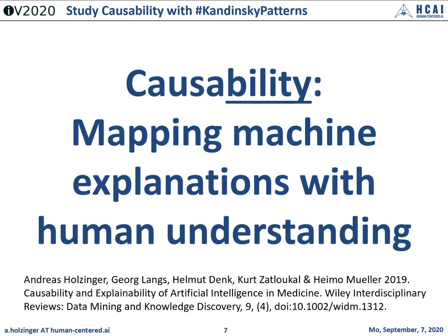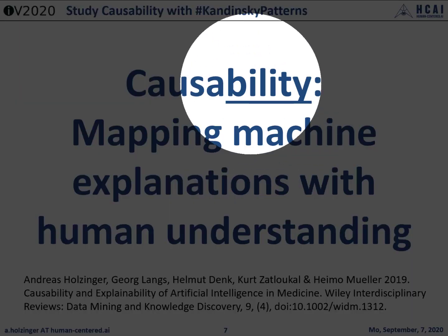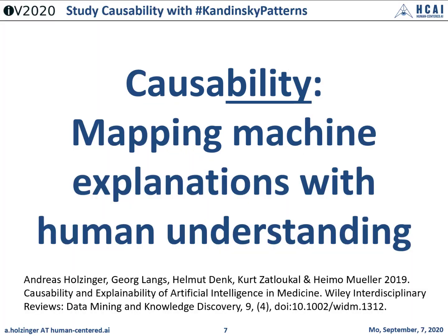We have extended this concept and introduced causability as the measure of the extent to which an explanation of a statement received from an explainable AI method, for example, receive an outcome from, for example, layer-wise relevance propagation, where the most relevant parts which contributed to one result are highlighted via heat map.